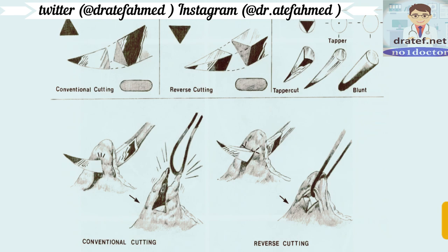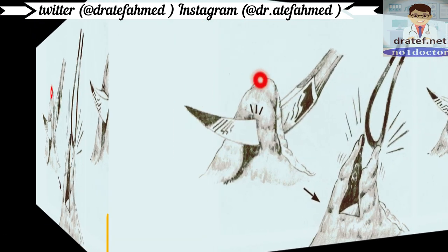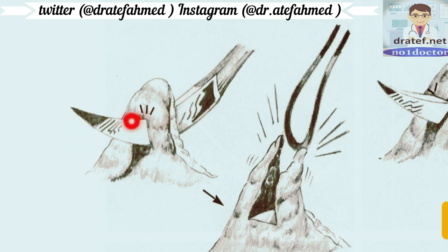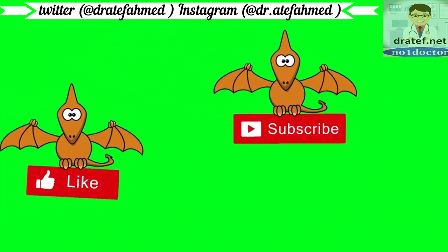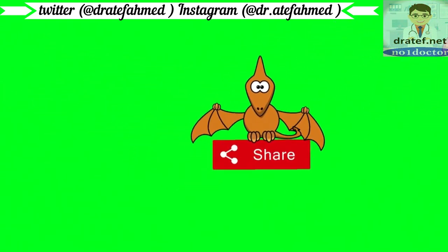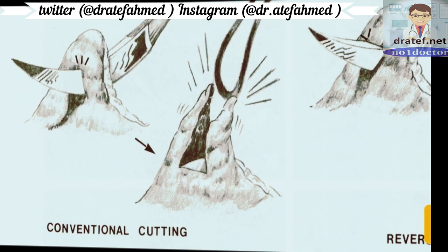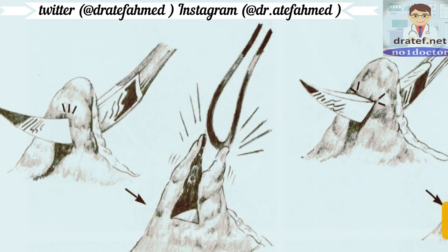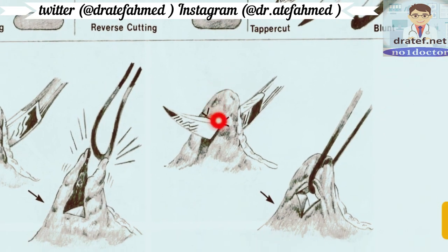In conventional cutting, the inner circle is the cutting edge. This may cause the soft tissue to tear and the suture may cut through, causing tissue trauma. But in reverse cutting, the outer edge of the circle is the cutting edge, and the inner edge is blunt — so it will not cut the tissue. That's why reverse cutting is preferred.